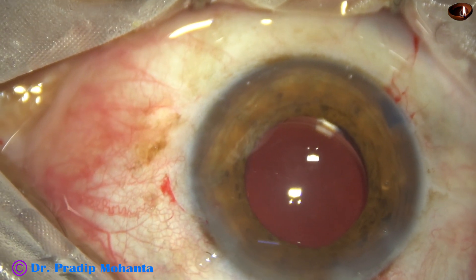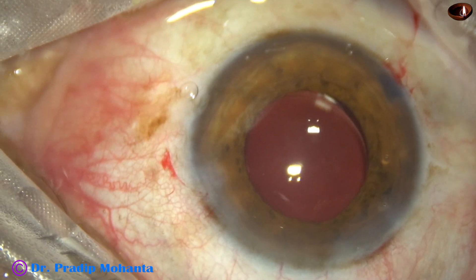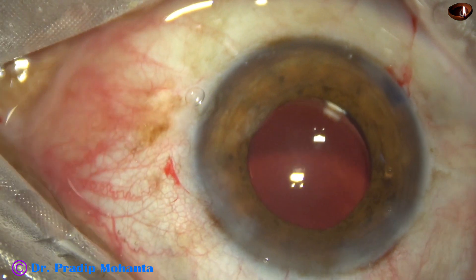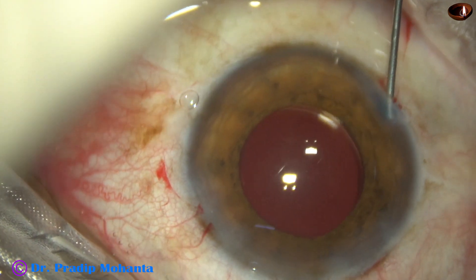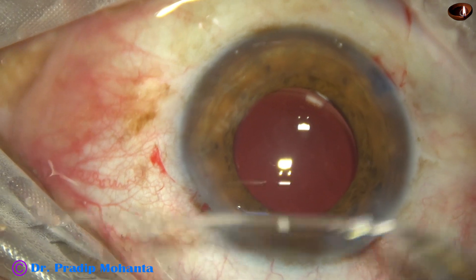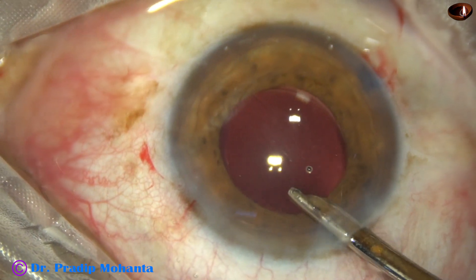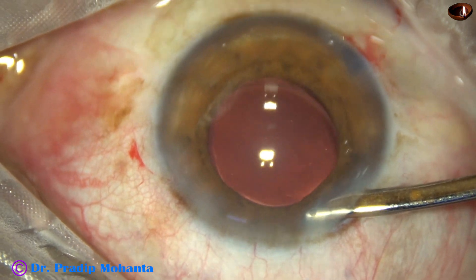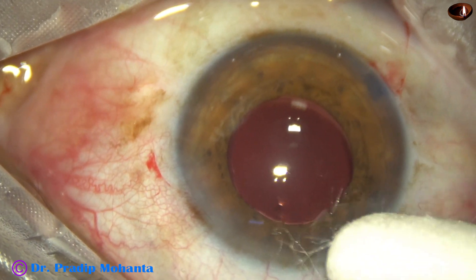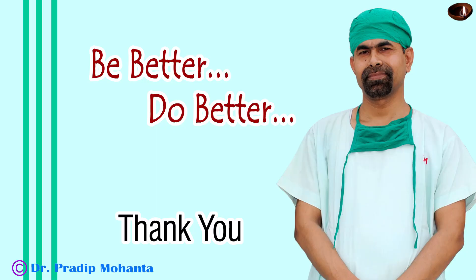And this is a bit of moxifloxacin. Now I close the side ports, hydrating corneal stroma on either side of these stab wounds. Finally, a last lavage of the anterior chamber — it is very important to prevent TAS, Toxic Anterior Segment Syndrome. The anterior chamber is nicely formed and the case is concluded.